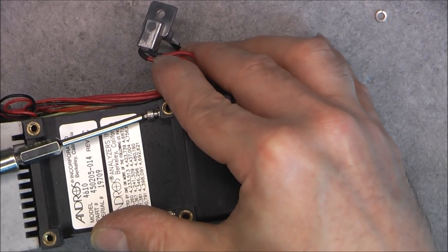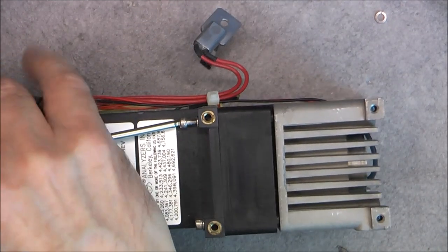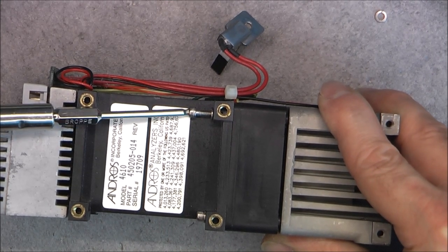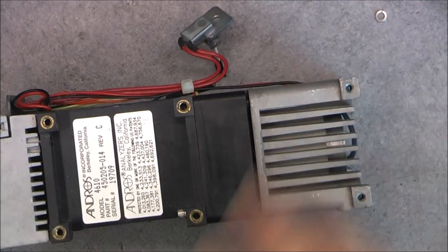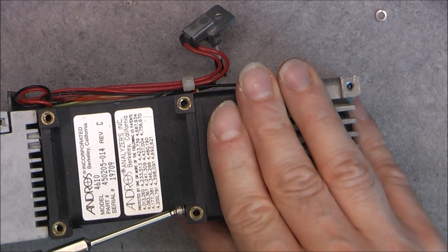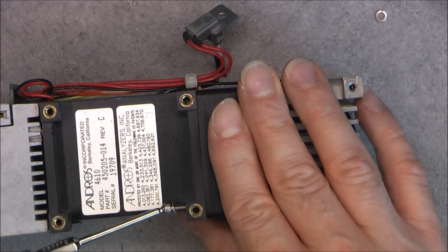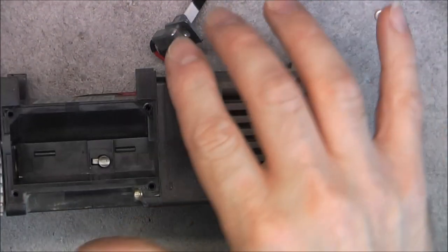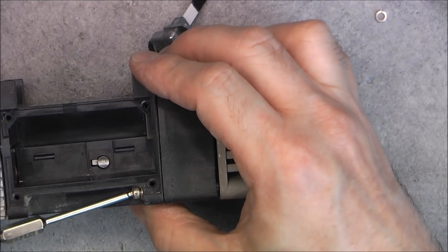Not sure about the size of Allen screws. This is working, but it does not seem terribly good. Upon reassembly, I will try to find a better matching tool, because this expensive little assembly, I might keep it as a collector item. Will probably be the first complete part I will keep from this device. So, yes, it is coming in parts.